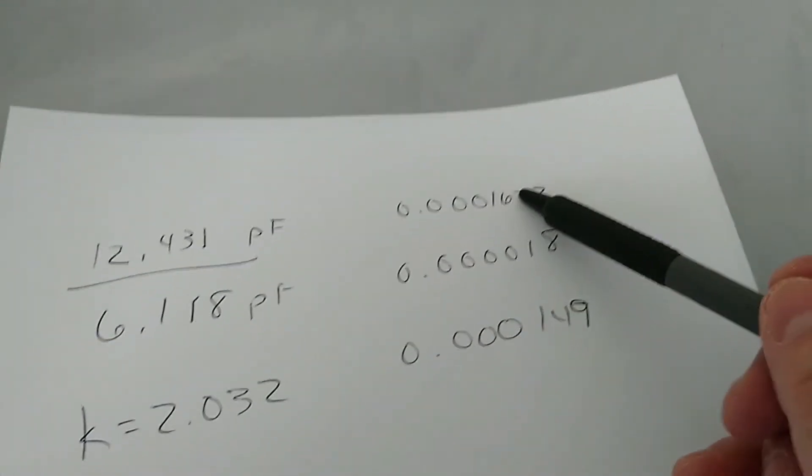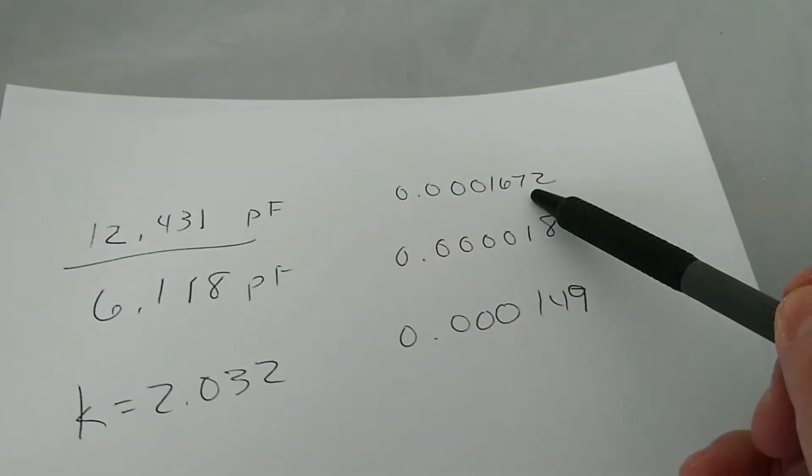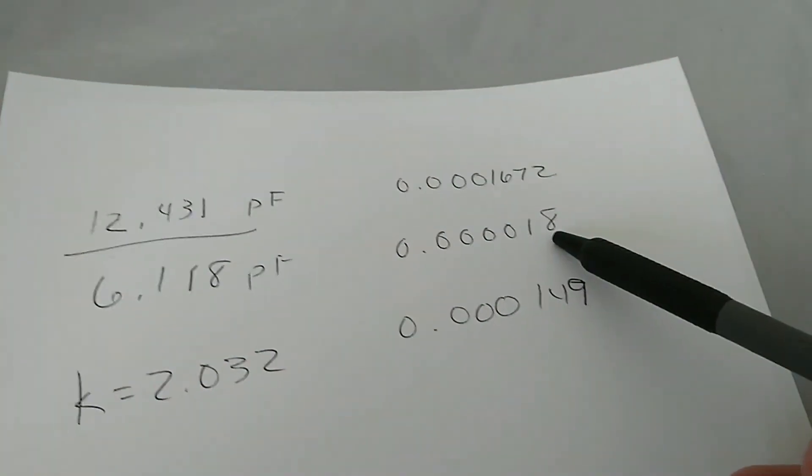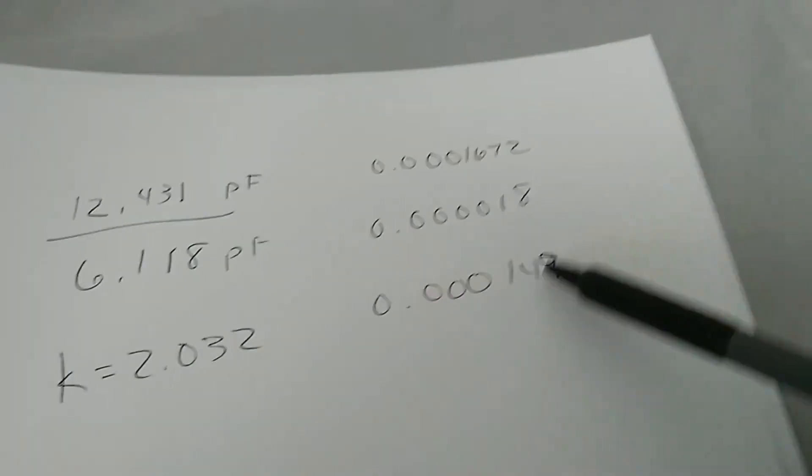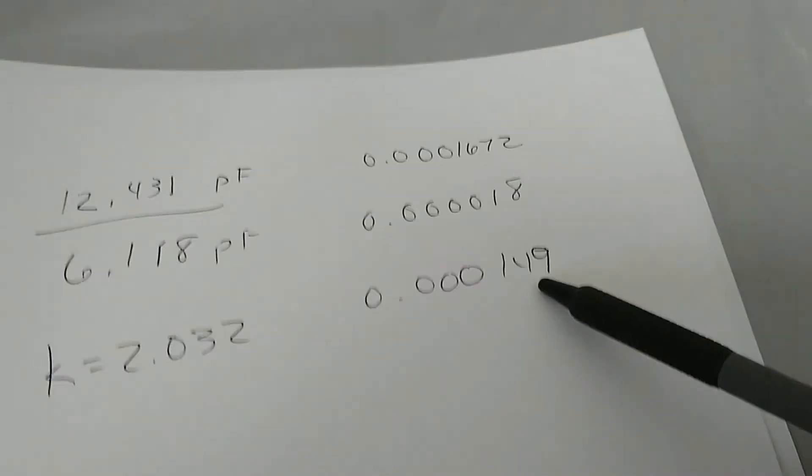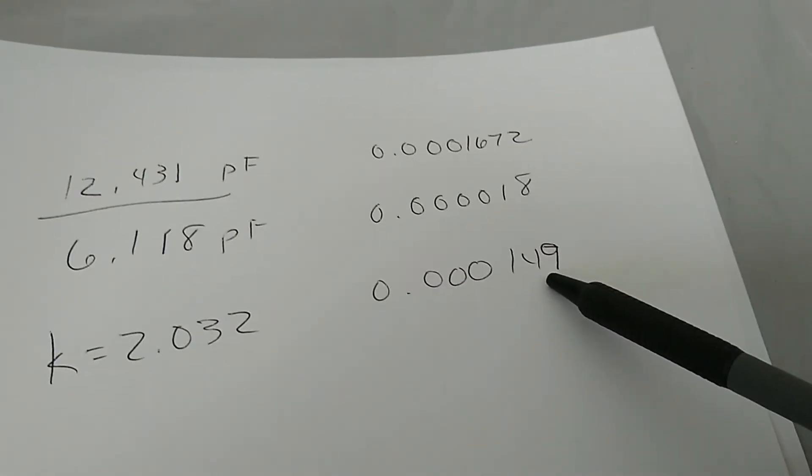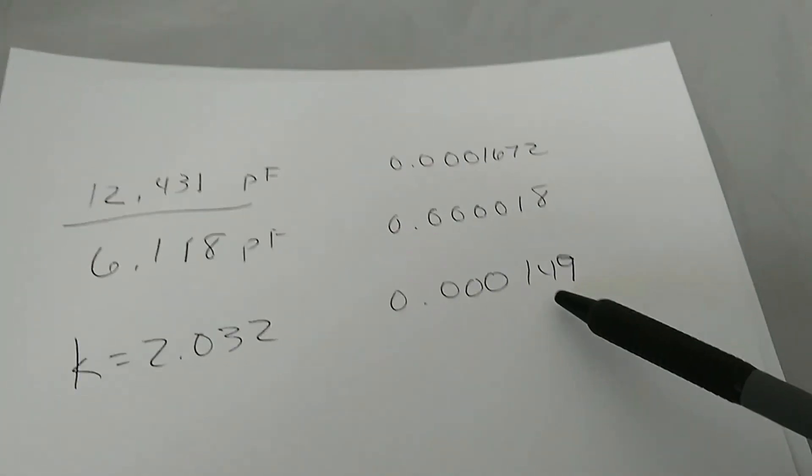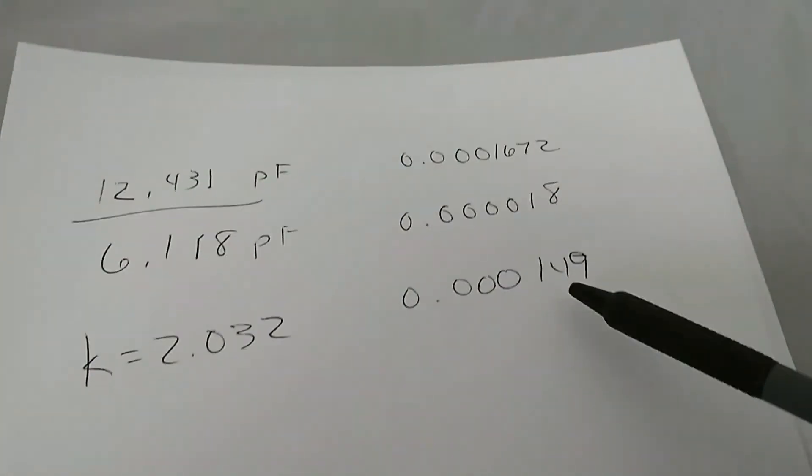We can also take the dissipation factor that we measured with the sample, subtract the dissipation factor in air. This gives us the dissipation factor of the material. So 0.0001, somewhat typical of Teflon, could be a little bit lower than that.